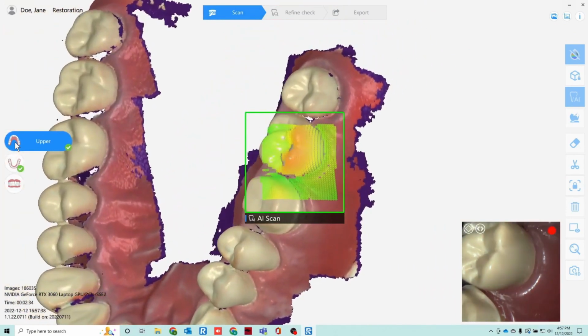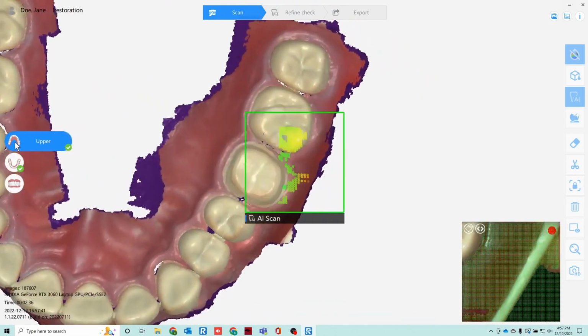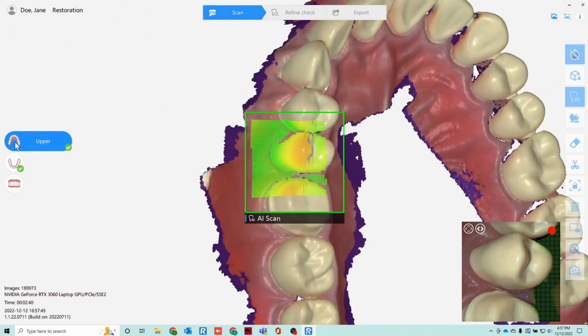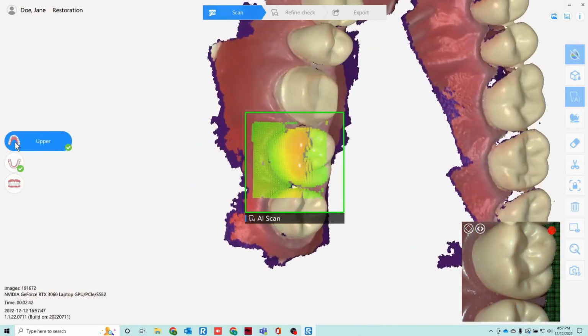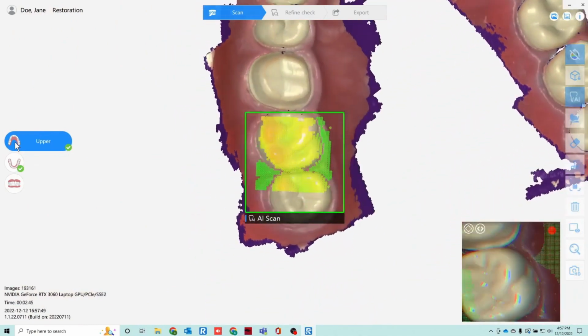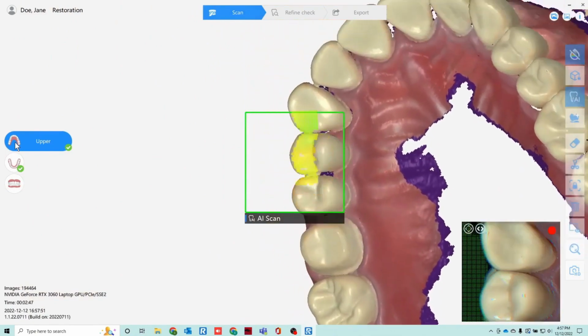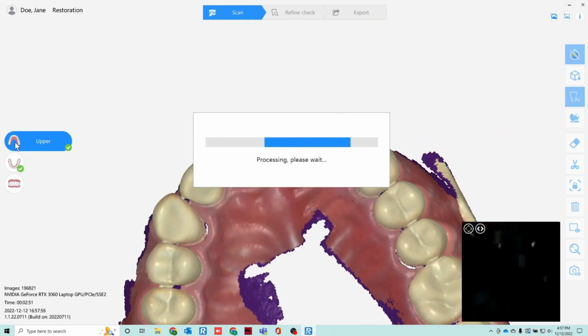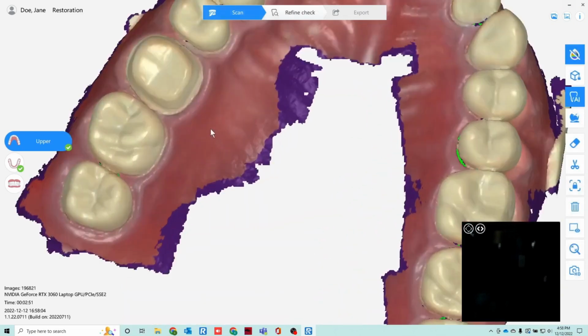As long as you get that prep, the tooth prep, and then the 2 teeth adjacent to it, especially the proximal aspect of it really good, then you're set. So make sure you double check that prep area, that there are no voids whatsoever, because that's the area of interest to you.